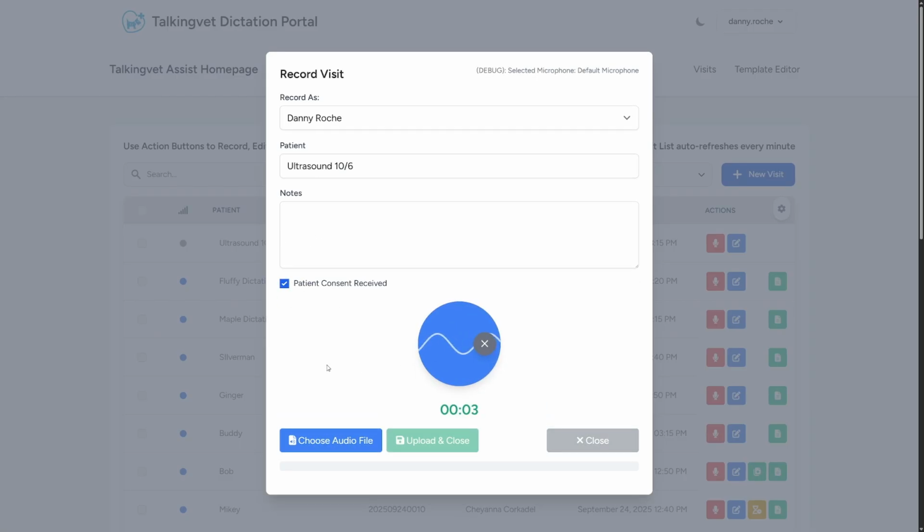All right, so today is October 6th, 2025. I'm starting the scan here with the liver. Looks pretty good overall. Margins are smooth, architecture is uniform, and I'm not seeing any nodules or obvious lesions. The portal and hepatic vessels are easy to follow and look normal in size. Moving over to the gallbladder, wall thickness is about 2 millimeters, contents are clean, and there's no biliary dilation. The spleen looks nice and homogeneous, measuring around 11 centimeters in length, with smooth margins and no masses noted.